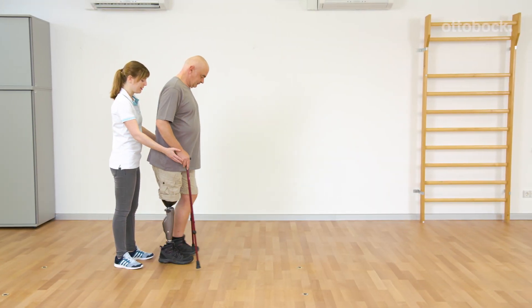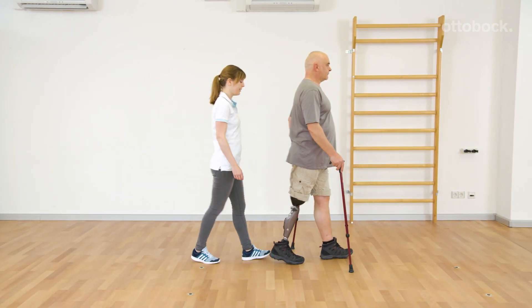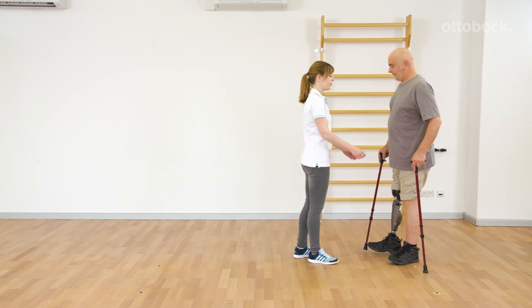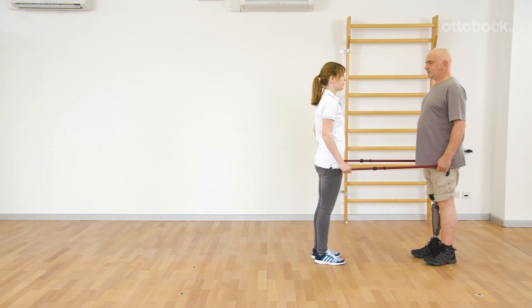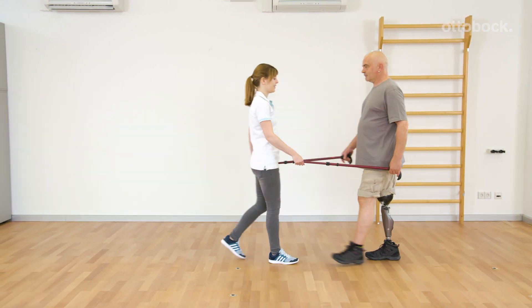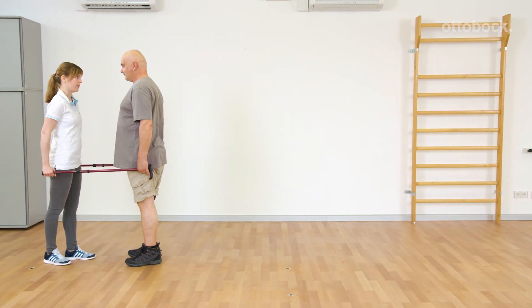When using two canes, the prosthetic side takes more and more load. Therefore, good balance is even more important. Reducing walking aids is a mental challenge and a big step for the individual. Outdoor training should be done with every change of walking aids. This increases self-confidence and is an important step towards independence.